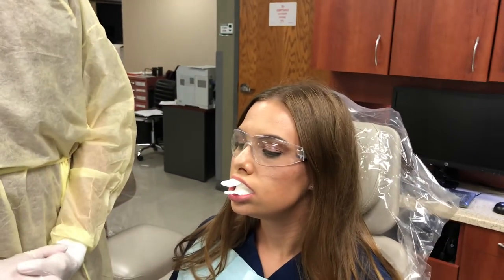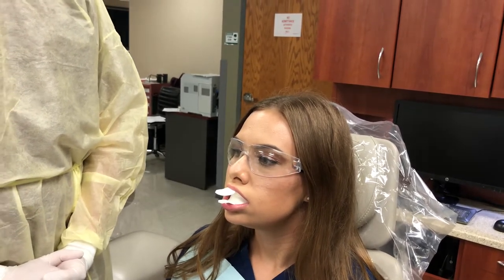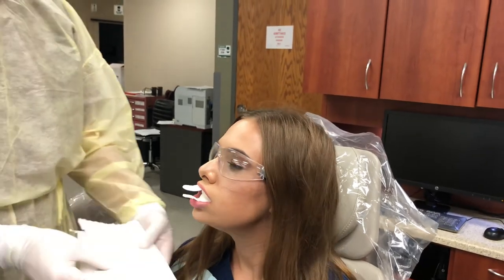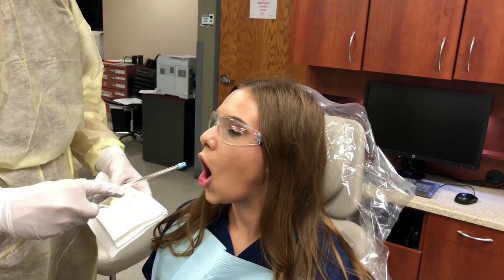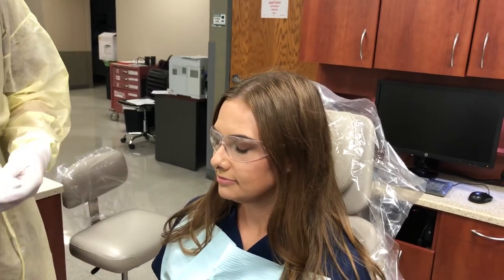You will not leave the patient. You will use a timer, and at the conclusion of the four minutes we will pretend that we are at that time. Then you will remove the fluoride trays — notice the paper towel because they will be dripping — and you would use your saliva ejector to help evacuate any excess fluoride and saliva.